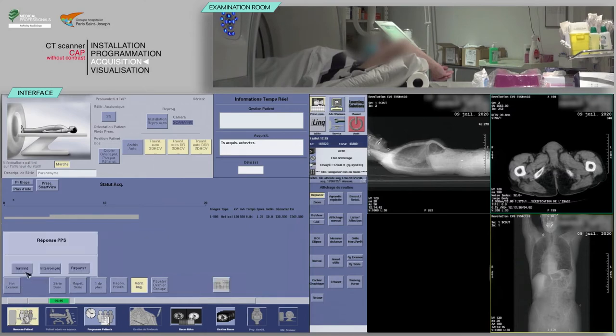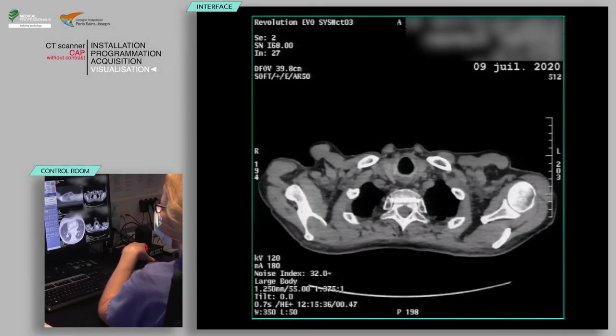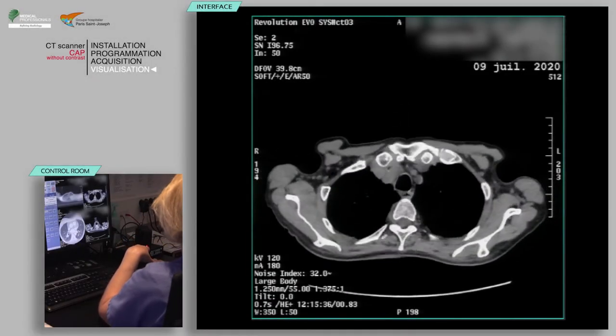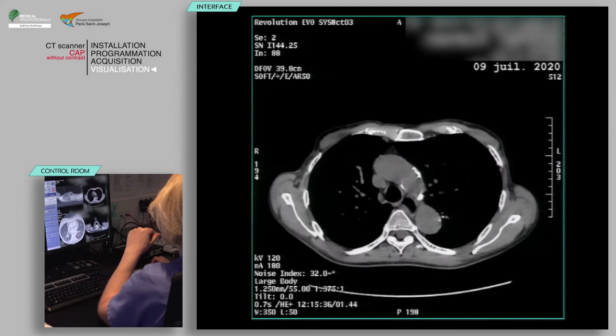After clicking on End Examination, you can do multi-planar reconstructions along with planes required by the radiologist.